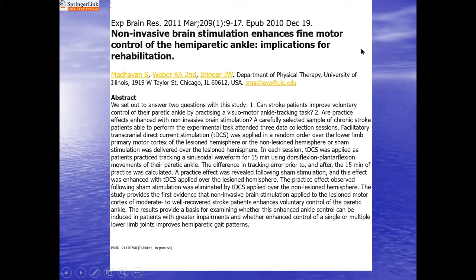They use stimulation for enhancing motor control in a stroke. There are people doing random noise stimulation to enhance sensory perception. There's all sorts of kinds of stimulation now, not just TMS and DC stim. There's also random frequency stimulation, as well as pulse EMF.